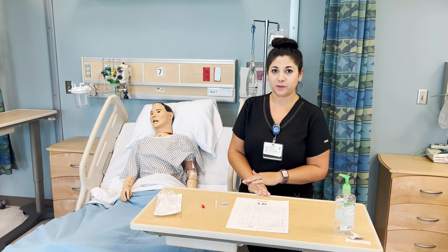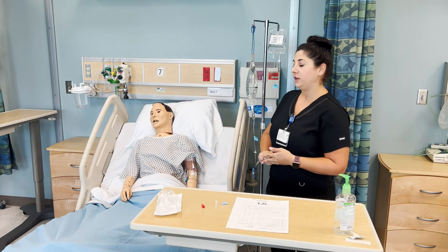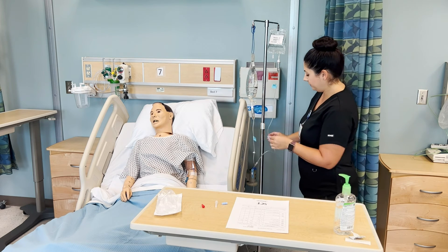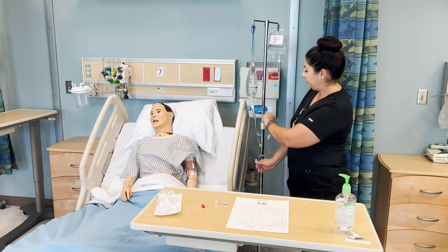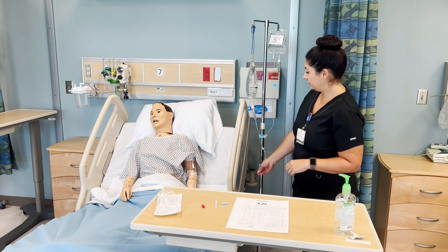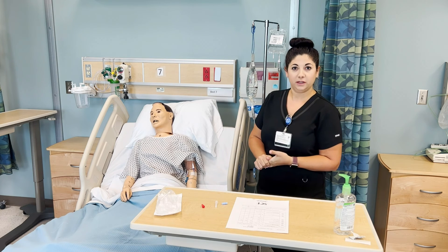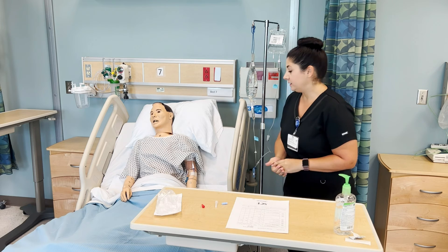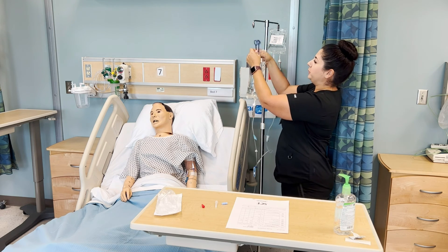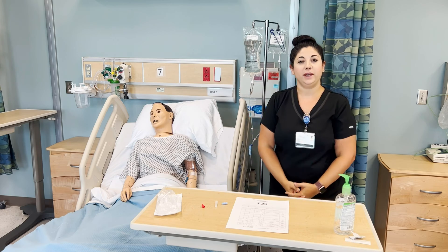60 minutes has gone by. I have knocked on the patient's door, introduced myself again, and told the patient that the medication is complete and I will be stopping it, going back to his primary medication. All I need to do is clamp here, and using this roller clamp, adjust the primary set back to the drip rate that is ordered. I will again assess my patient's IV site, making sure there are no signs of phlebitis or infiltration, and ask him how he's feeling and if he's having any side effects. I will wash my hands, document that it is completed, put this back up, and save it for the next time we have to give this medication.